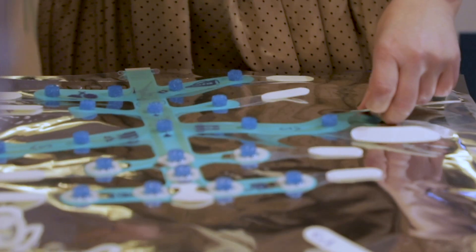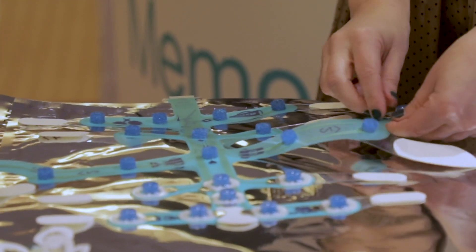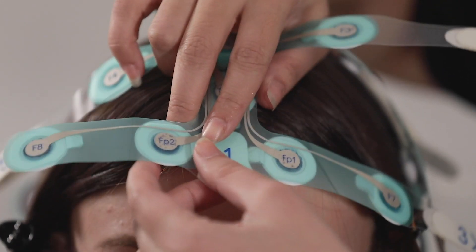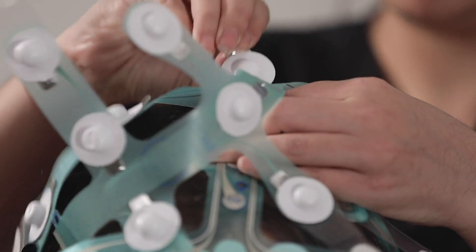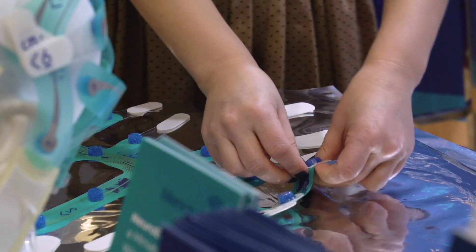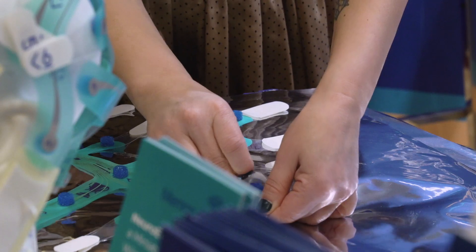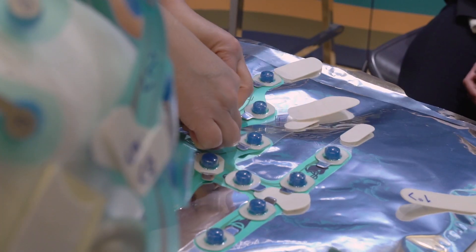Prepare NeuroCap: place the NeuroCap flat and carefully, one by one, remove all the blisters from the electrodes. Alternatively, you can first place the NeuroCap on the patient's head and then remove blisters one by one during setup. To successfully apply NeuroCap, follow the number sequence marked by different parts of the cap, starting with number one.